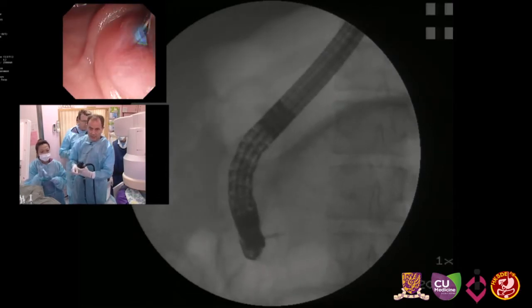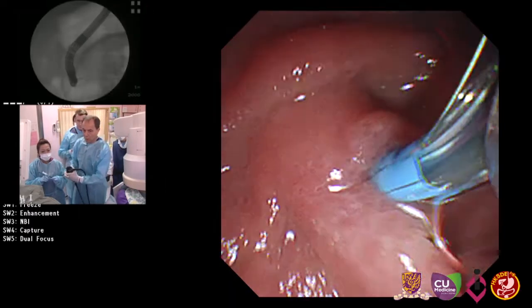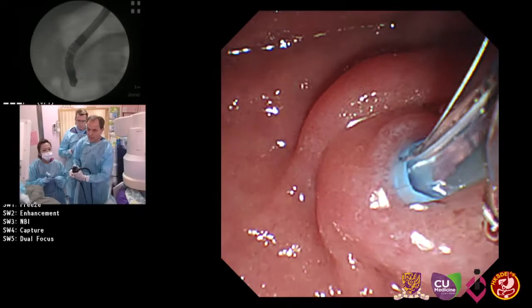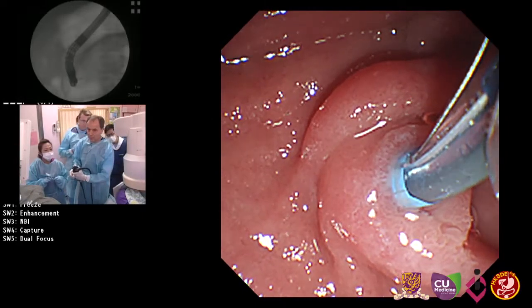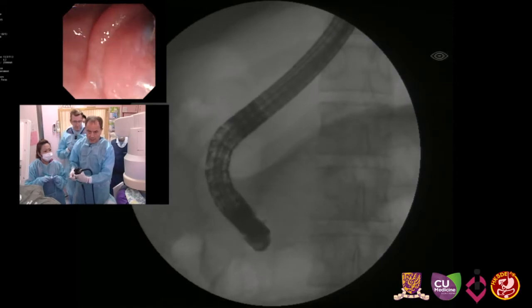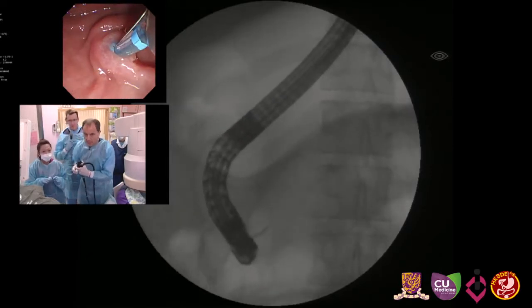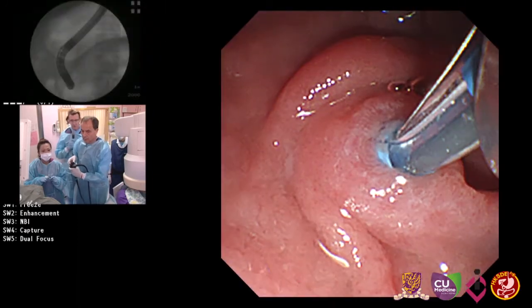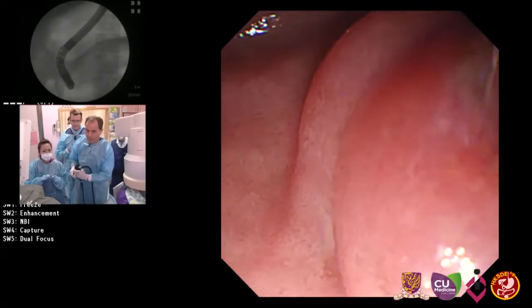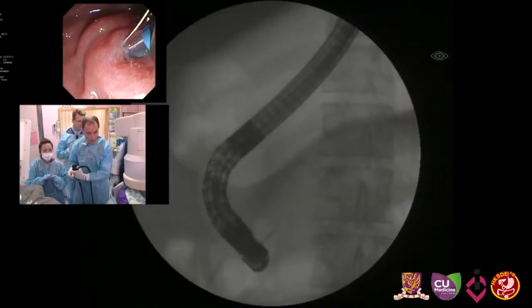Now, so far we don't see it, so I change the position again. It might be very narrow according to what we saw on MRCP, so I carefully move around a little bit. Try again now, firstly, to push the wire forward. Okay. And then you see, it's not necessary to screen all the time when you're working with the wire, because the cues come to Natalie and to Horst that the wire is either feeding in or not. So you don't have to screen continuously. Which wire are you using now, Horst? This is a hydro wire with a hydrophilic tip. Now did you see that pop? You noticed, yes. Then now push the wire forward a little bit.